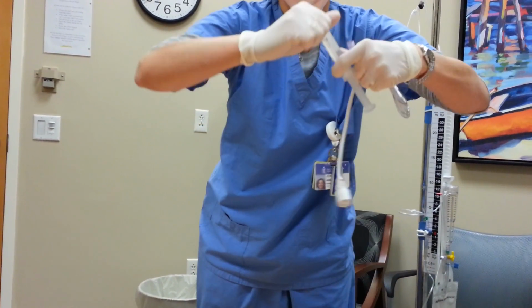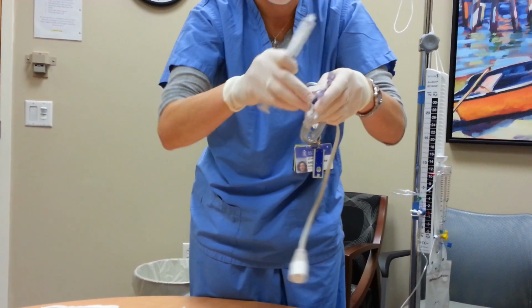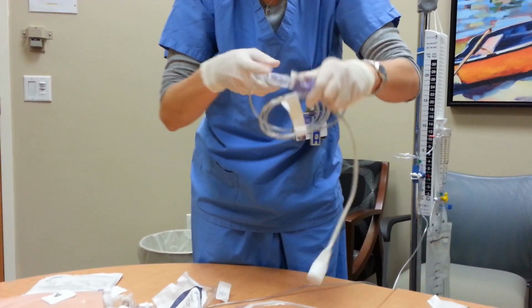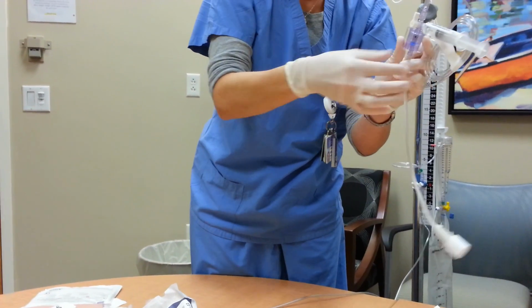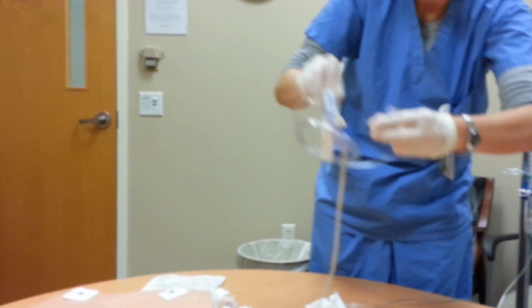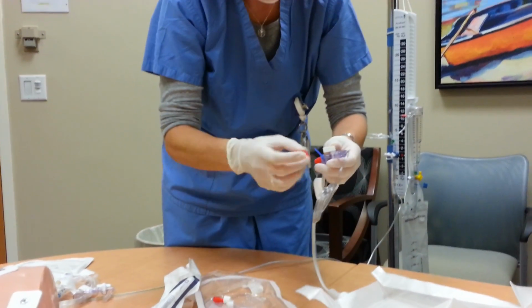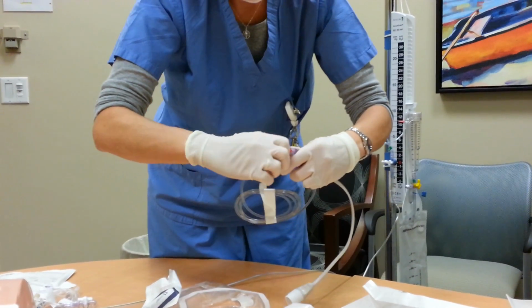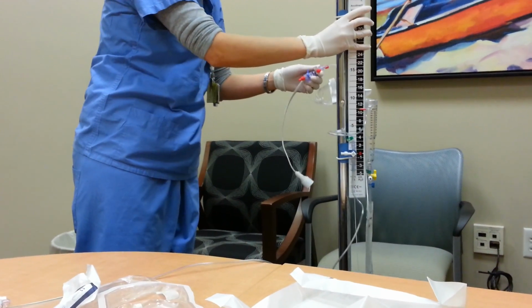Then you take your normal saline syringe, get rid of the air bubble, and you prime it. Just have to make sure it's primed in all 3 directions by using the stopcock. When you prime going this way, you have to pull the blue tab while pushing the plunger on the syringe, or water won't pass through it. So once you do that, you can add all the caps. And you're ready to attach it to the system to transduce the pressure.